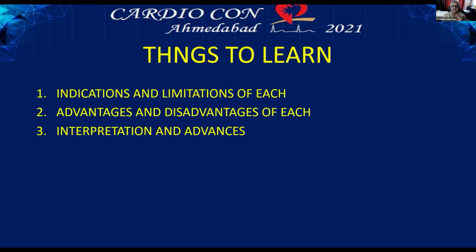Saline is something that you've got to get used to. What I do is, as a protocol, I always try saline first. I'm not successful in all the cases. Sometimes saline just doesn't give me images, in which case I quietly switch over to contrast. So in this bargain, I'm trying to fine tune my methods in which I can use saline in the majority of the cases. About 70% of the cases, with or without the help of a guide liner, I'm able to use saline as the OCT medium. So these are the two things I would like to say. And I totally agree with Chirag.